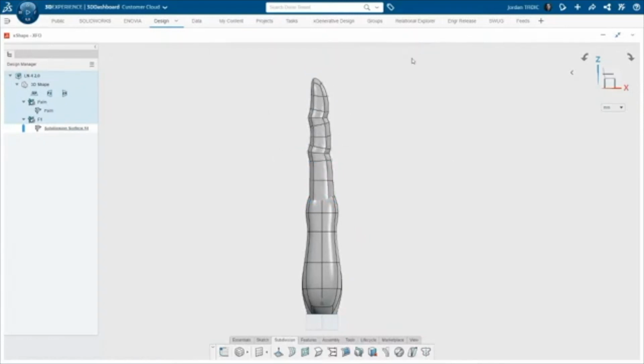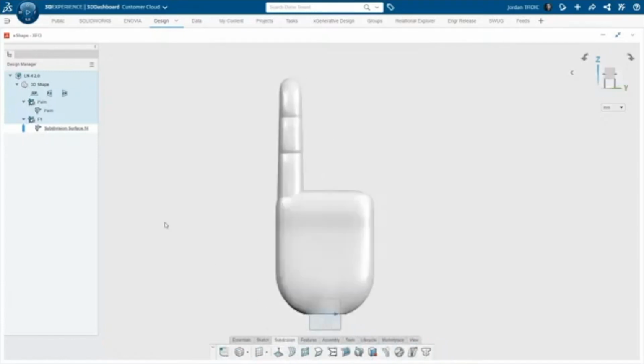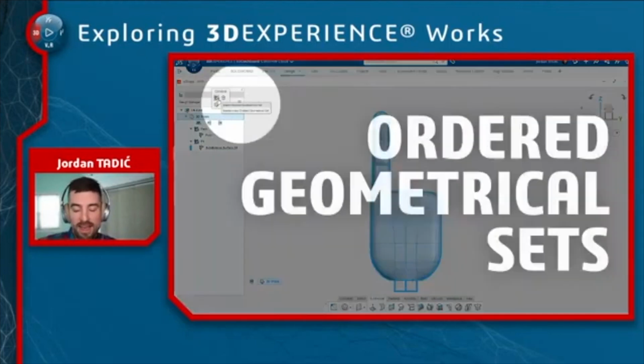Now, when I'm scoping out the model, checking the progress, I like to hide the tangent edges so that the model is going to look more like it would in real life. And I could see how the light's reflecting off of it. And now it's time. I think we've got a decent looking finger at this point. Let's talk about creating the other fingers, the other 4 fingers on the palm of this hand.